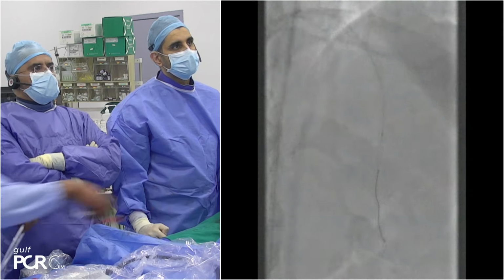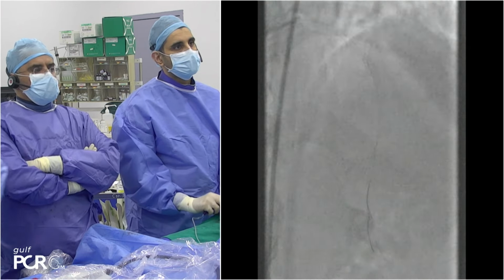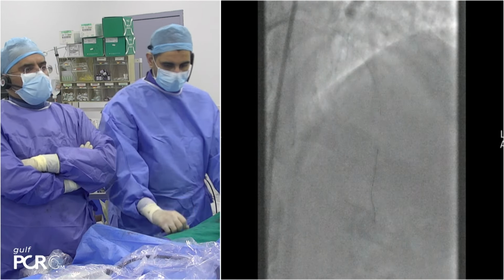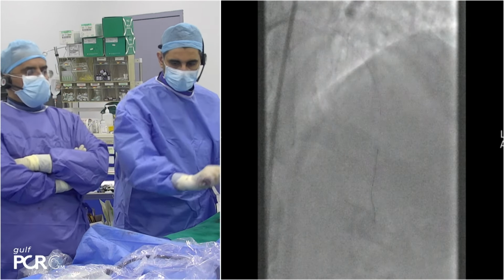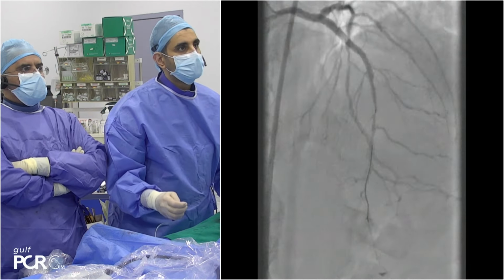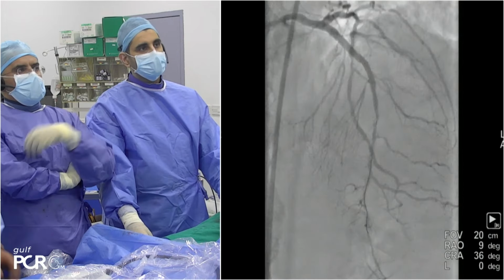So obviously, we worry about the immediate result more so than the long-term result. So in this case, the edge and the outflow is, for us, a safety issue rather than long-term results. Okay, let's look. Go cranial. Cranial.